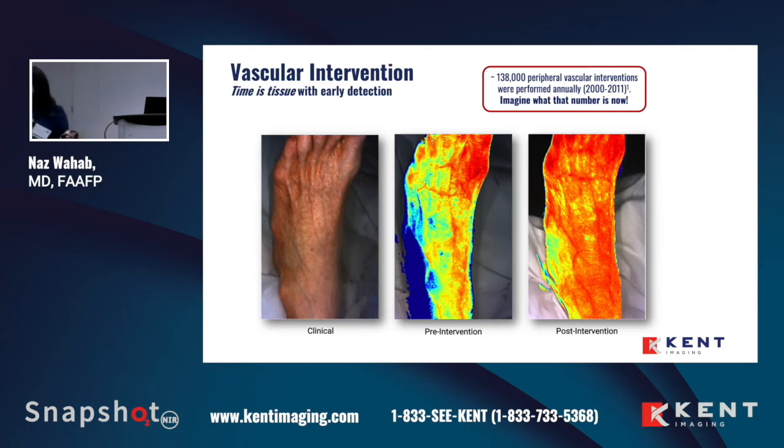Vascular intervention. Once again, the skin is an organ. And so are we getting end organ perfusion is really what's interesting. And I think it should be utilized in addition to post-intervention imaging. So here we can see there are no wounds here. This is a clinical claudication that the patient was coming in with.